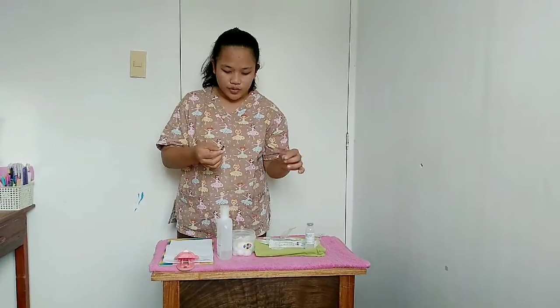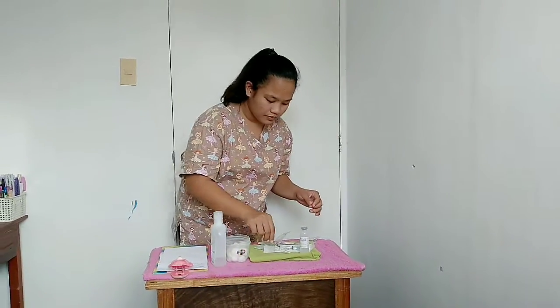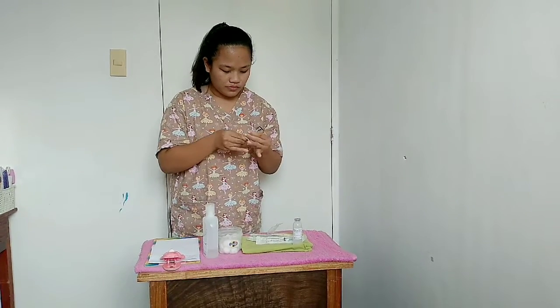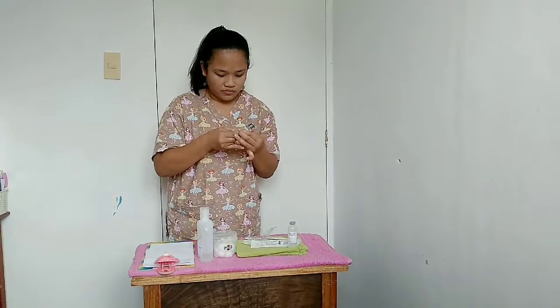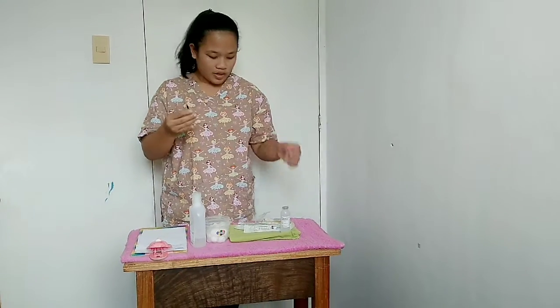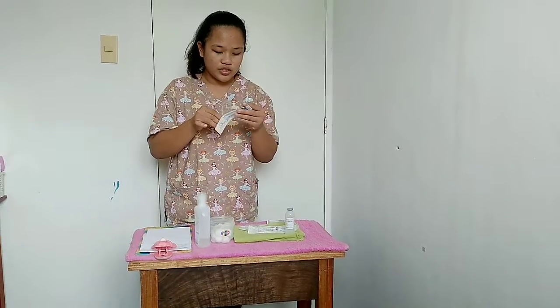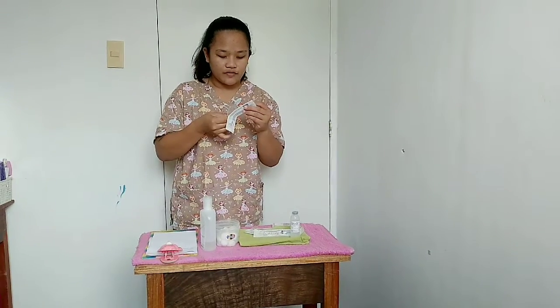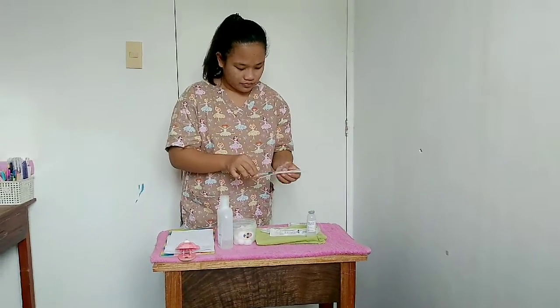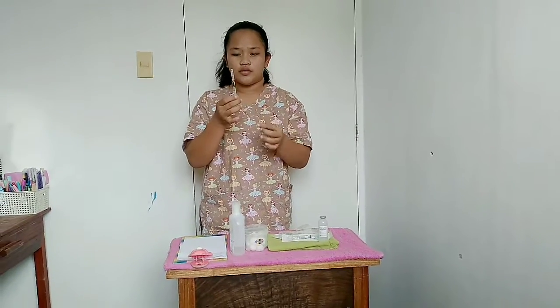Now we are going to remove the aspirating needle and put back the original needle of the injection. Make sure that it is not loose.